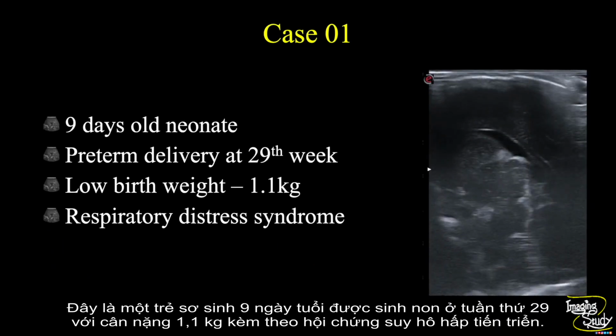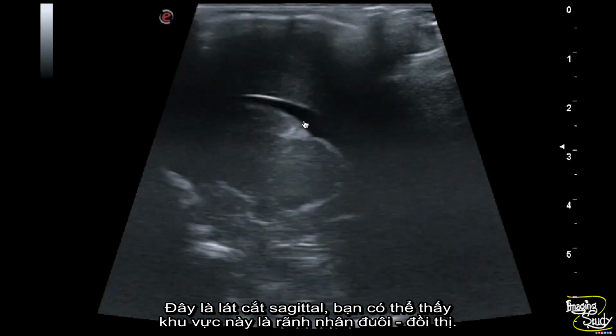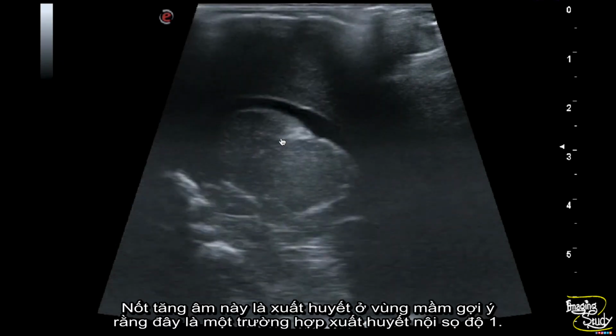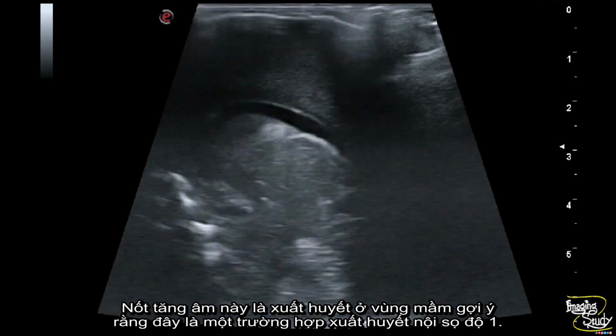This is a 9 days old neonate with preterm delivery at the 29th week with a low birth weight of 1.1 kg with respiratory distress syndrome. Here on sagittal section, you can see this area is the caudothalamic groove. You see there is a bright hyperechogenic area at this caudothalamic groove. This echogenic focus is the hemorrhage at the germinal matrix, indicating it as a case of grade 1 intracranial hemorrhage.